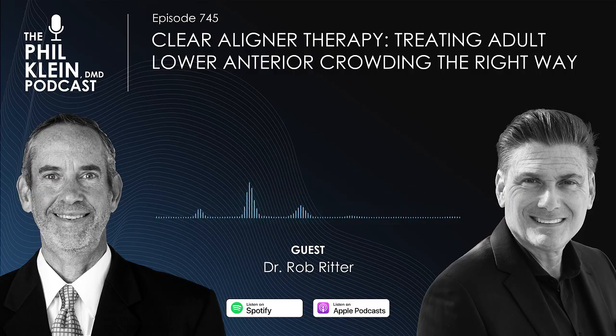Now, what we've evolved into is what we call expansion and MARPE, where now, because we know in addition to the teeth being not in the right position because of the first premolars, we know about airway. What did that also do? It retruded the mandible, constricting the airway by pushing the tongue back. So now what we're doing is we're expanding the maxillary arch and trying to expand the mandibular arch to accommodate more room for the teeth, opening up the airway, letting the tongue come forward. So now we're not taking teeth out anymore. The orthodontists are expanding them either with functional appliances and or in conjunction with traditional ortho or even Invisalign.